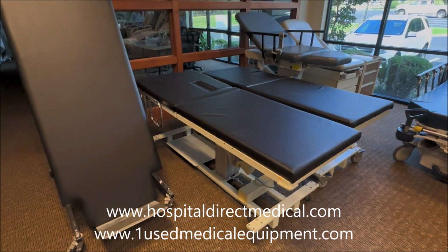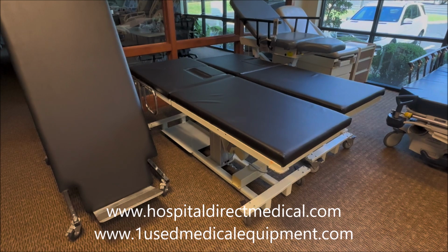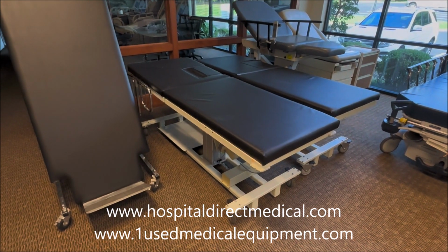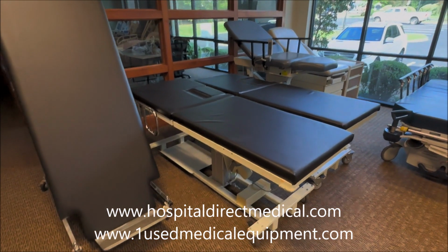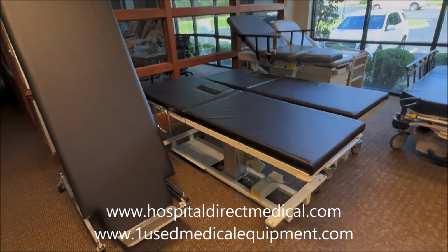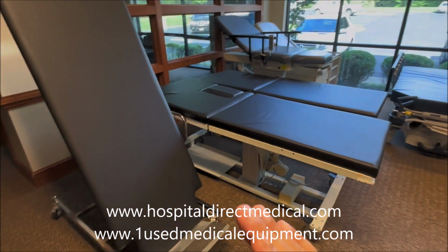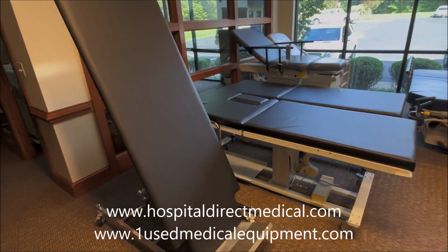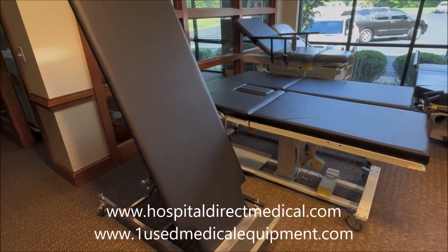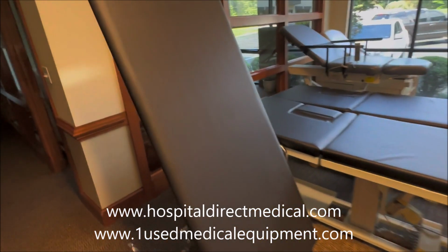But basically, there's multiple kinds of ultrasound tables. Primarily, though, you're going to see them for cardiac-related things and OB/GYN, and then vascular, what we would call vascular studies. The biggest difference between a vascular ultrasound table and a cardiac table is that a vascular table is going to do Trendelenburg, meaning it's going to be at an angle. If you can see here, for the sake of the video, I turned this one up so that you can see it when it's fully up. And basically, this is a vascular table right here.